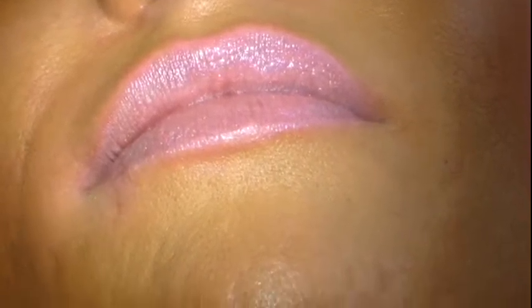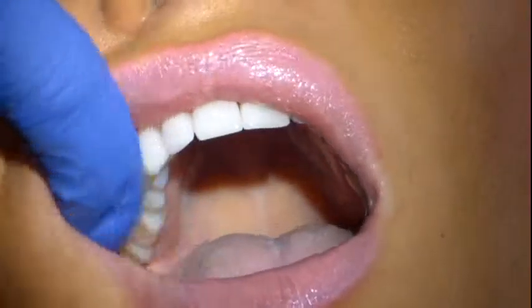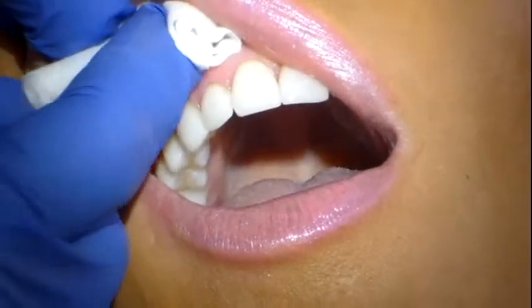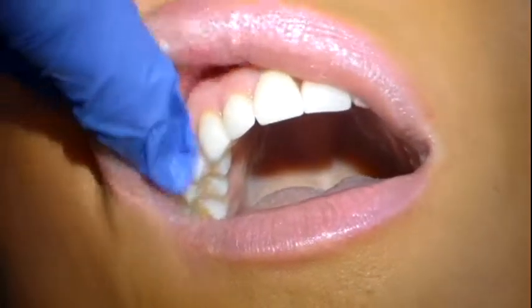Okay, so we're going to demonstrate the ASA injection, the anterior superior alveolar injection. And the first thing you always do is debride the area with gauze to get the bacteria out of there and to make sure it's nice and dry for the topical. And then you're going to put the topical on.